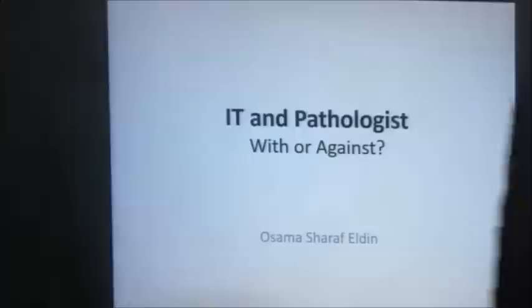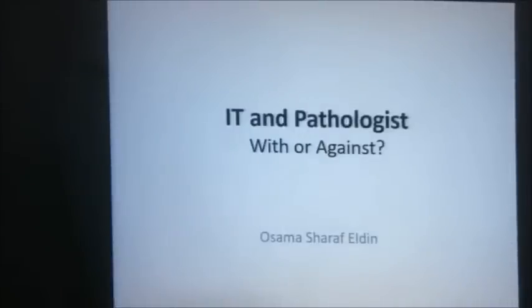This is a very important task today. From next week, actually in our department, we are going to have everything digital. So there will be no use of microscopes from next week, and we are going to report everything online. So all the slides will be scanned using a high resolution scanner and put online, and with all the patient data can be seen. You can see everything about the patient, all the laboratory results, everything about the radiology, everything in one screen.